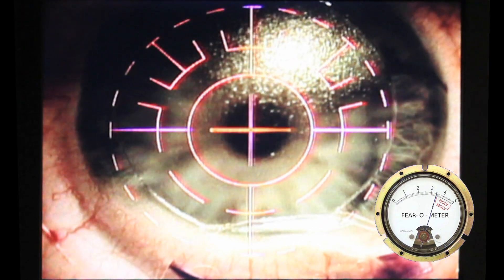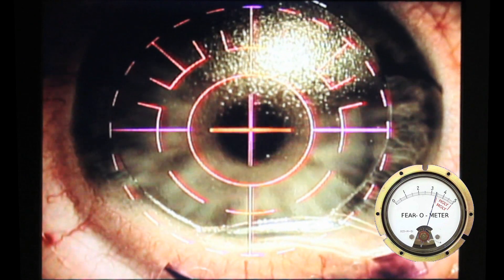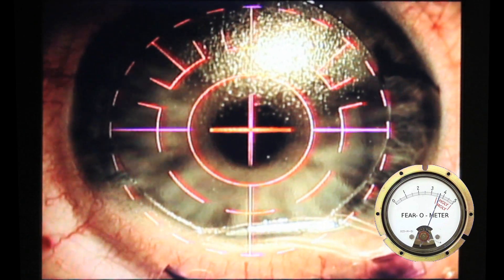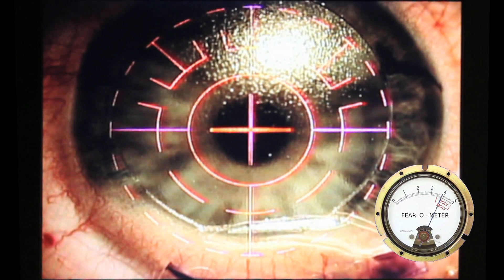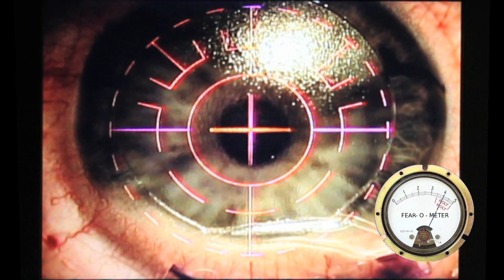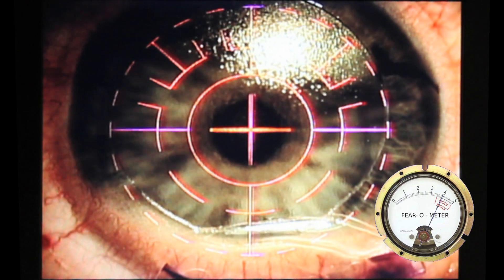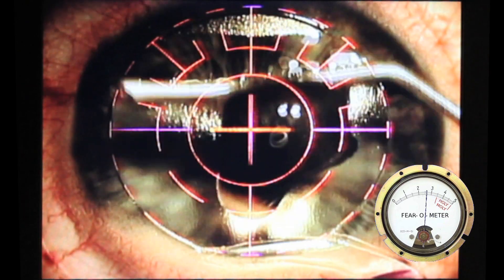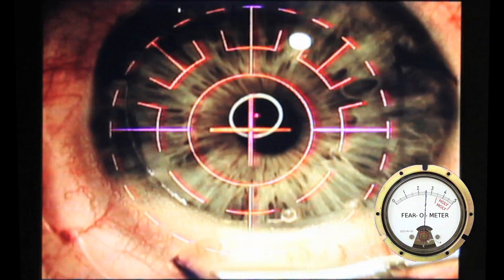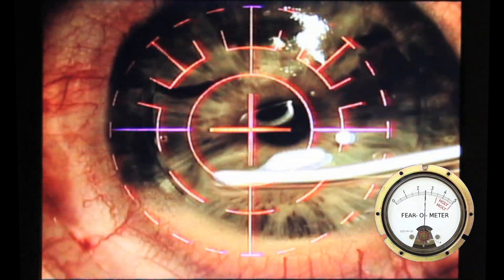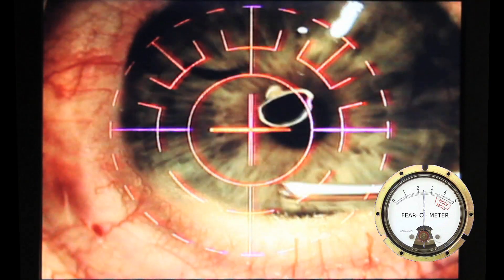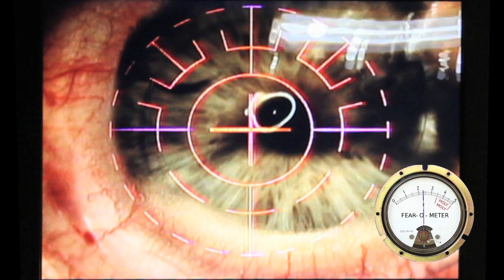Now, I'm told that this laser will lock on and not fire if you move or anything like that. You can see here he has a lock. And he starts firing. At this point, I actually asked my doctor. I said, hey, what's that smell? Is that what I think it is? And him being the joker that he is, he says, yes sir, that is burning flesh. So, you can actually smell your eyeball burning if you're so inclined to actually think about it. Which I was. I was asking him what wavelength the laser was and stuff like that. But he's a pretty cool guy.